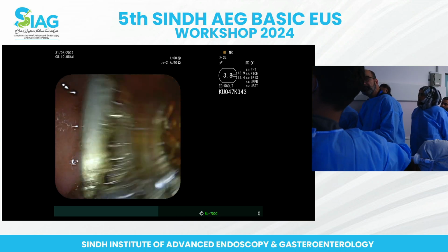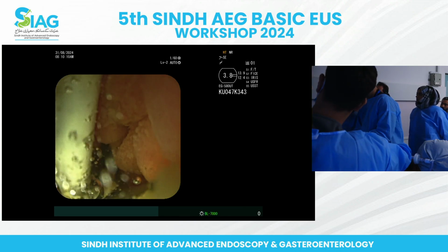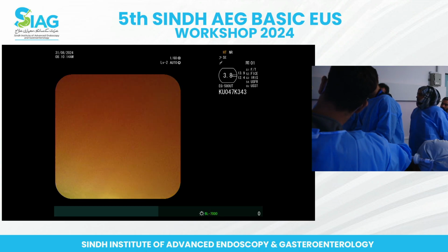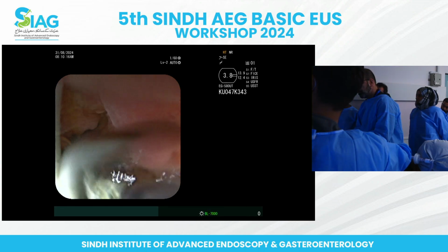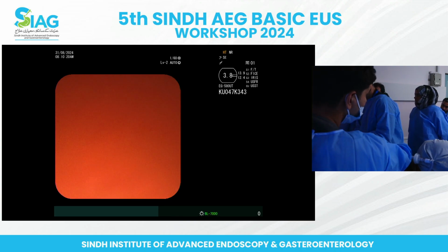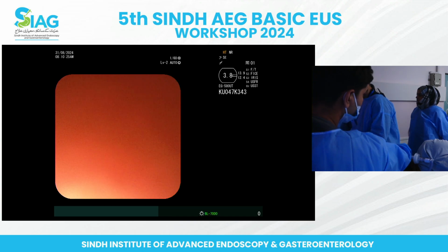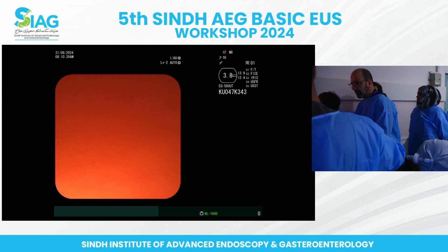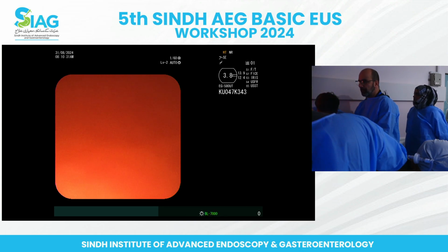There's a lot of sludge coming out of the bile duct. And we did ampullary biopsies before.